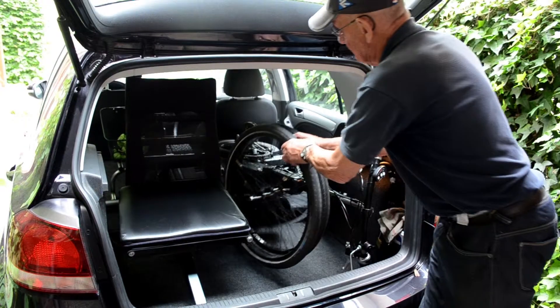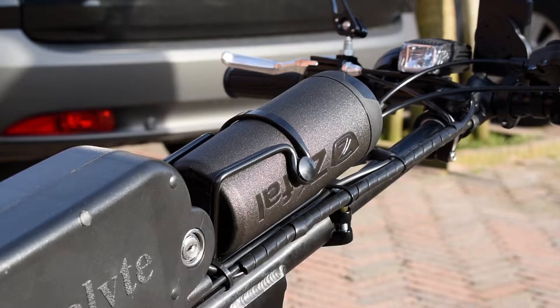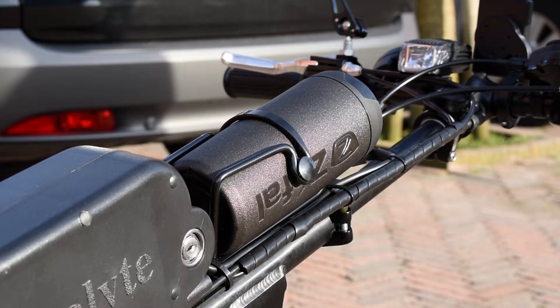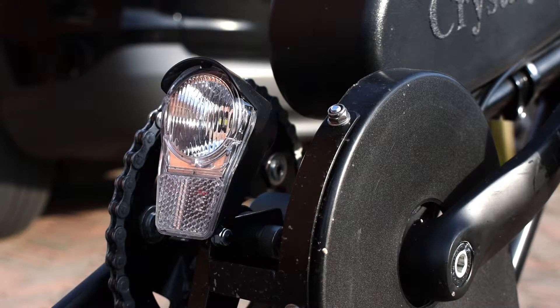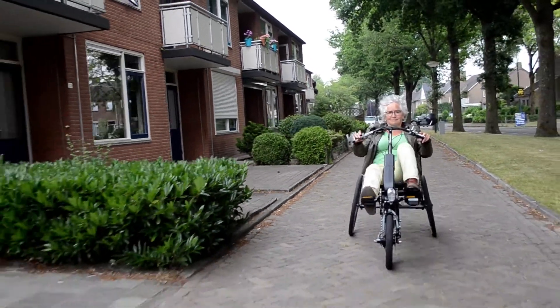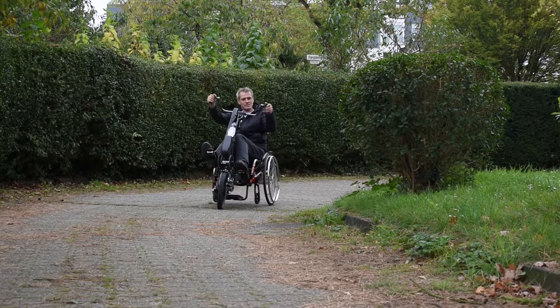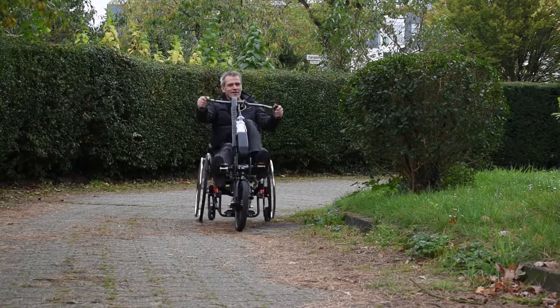Our tricycles can be transported in the car, even with the electrical pedal assistance. The brushless motor requires no maintenance and is powered by a lithium-ion battery with a long lifespan. The battery can be disconnected for transport or for charging indoors, and can also be easily replaced with a spare battery, even when you are on the move.